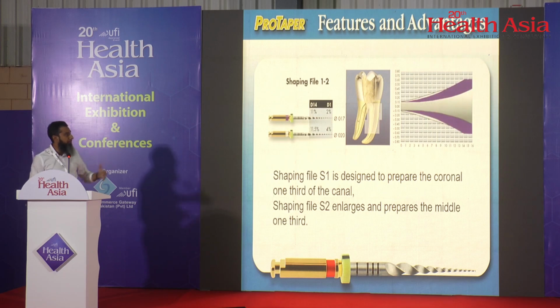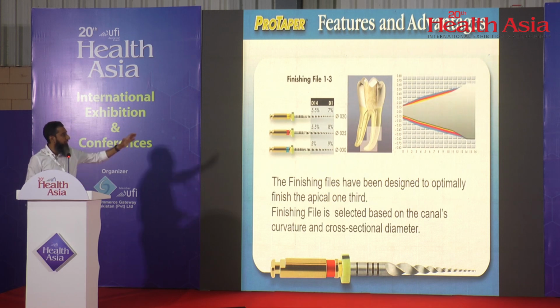Then you have the shaping files. You can see they're wider in the middle or coronal part, but they're very narrow in the apical part because their purpose is to enlarge the coronal 2/3. And for the apical 1/3, you have the finishing files. The yellow one, F1, red one, F2, and then the blue one, which is F3. You can see here, their taper in the apical area is far more than the shaping files.